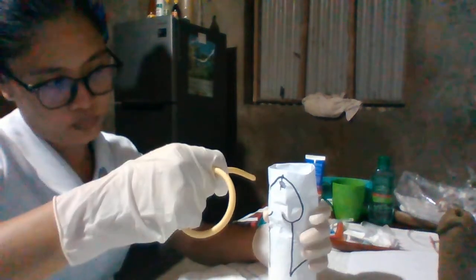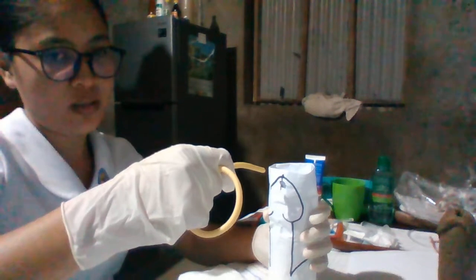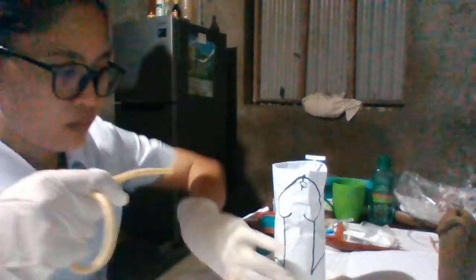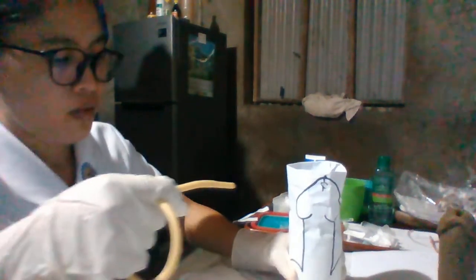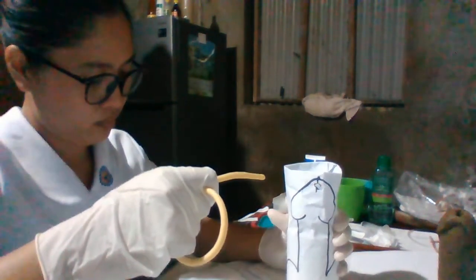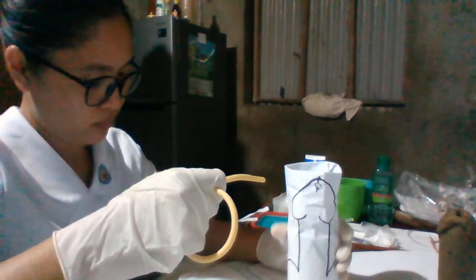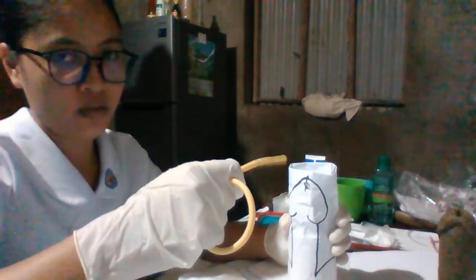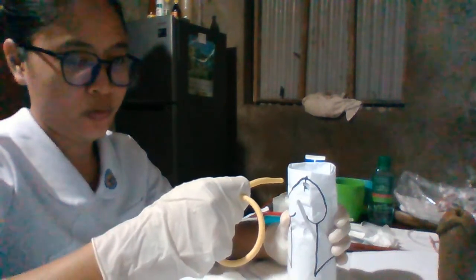Then position it in a perpendicular position, and then ask the patient to bear down as if to void when we are going to insert it.